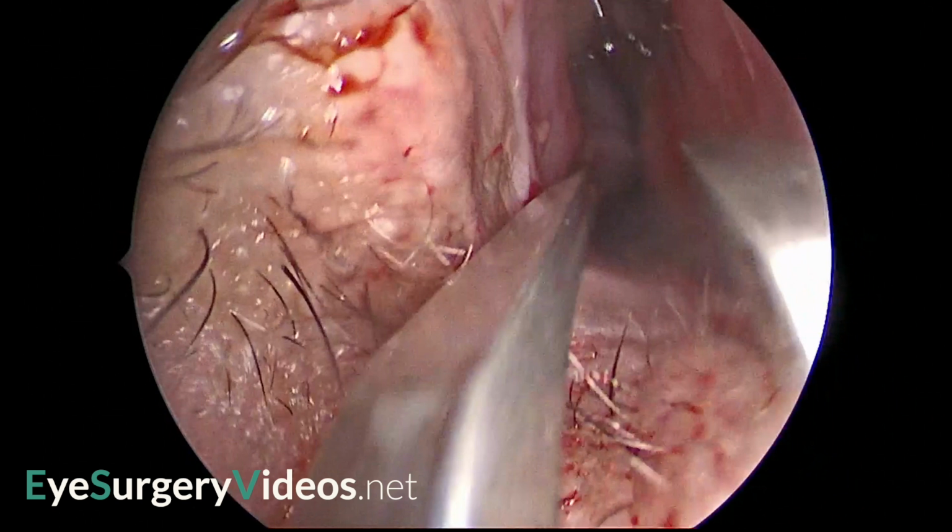A single small, tight knot has the advantage that stent removal can usually be achieved by cutting the loop at the medial canthus and pulling one end, and the knot is small enough to pass retrogradely out of the nasolacrimal system, obviating the need for an endoscopically assisted removal. However, one does wonder if this might cause mild trauma to the delicate epithelial lining of the already stenosed system, and perhaps removal under endoscopic guidance may be safer.